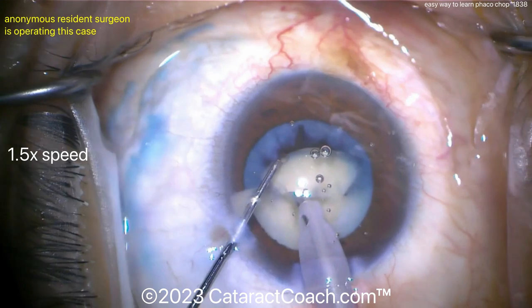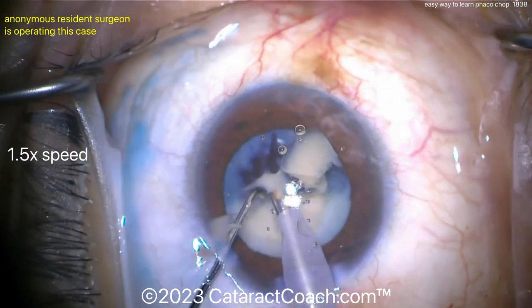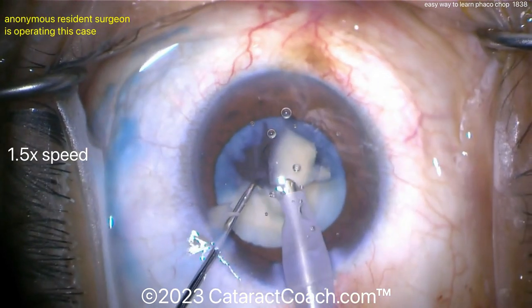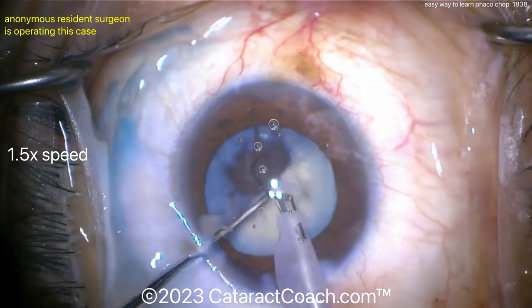Another quadrant brought up and chopped into eighths — very nicely done. I like how the eye is staying in primary position. Good draping, and the speculum looks good as well. Everything looks pretty nice here. I have sped the video up slightly — it wasn't just four minutes to create the four quadrants, it was actually six minutes because the video is at one and a half speed.